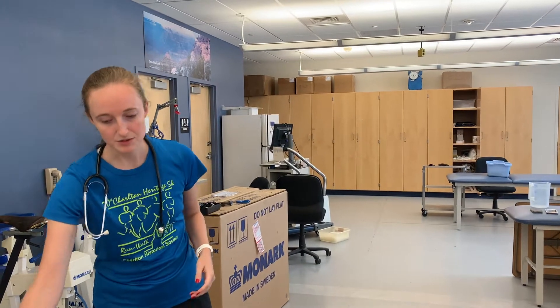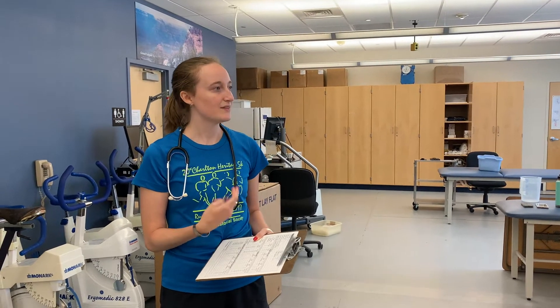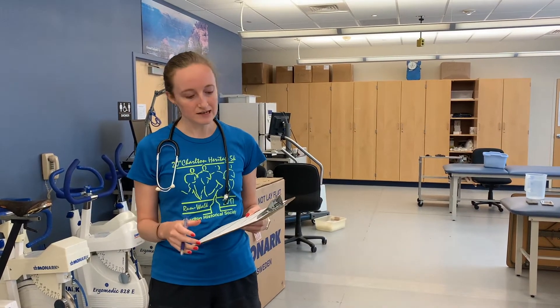First things first, we have our data sheet here which we're going to use to record a supine heart rate, blood pressure, and RPE. We'll do that first, then get him standing up and do the same thing — blood pressure, heart rate, RPE — and then start the test. Our goal is to get him to 85% of heart rate reserve, which we've already calculated to be 170. We will be doing the Bruce protocol until he reaches a heart rate of 170, and that's when we will stop the test and begin our resting portion.